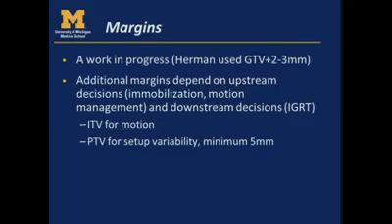So margins for SBRT. In the multi-institutional study, Joe Herman and his collaborators used a GTV plus 2 or 3 millimeters. I'd say it's really a work in progress and should usually be done in a clinical trial again. Any additional margins really depend, just like in the liver, on any of the upstream decisions that you made about immobilization and motion management.